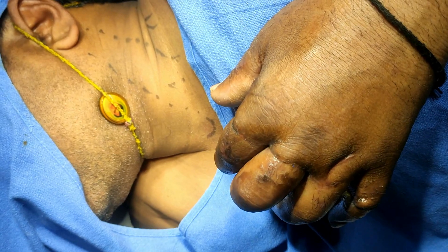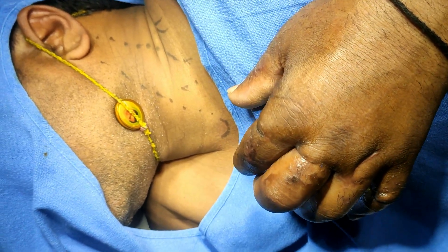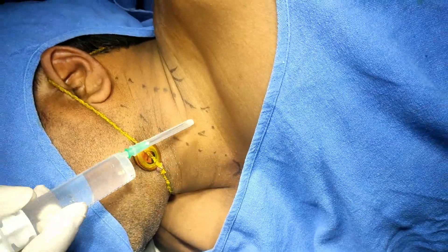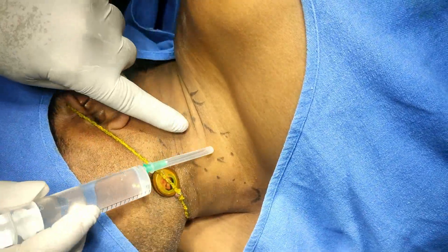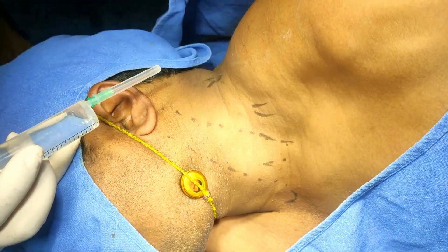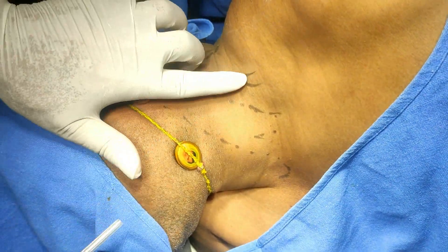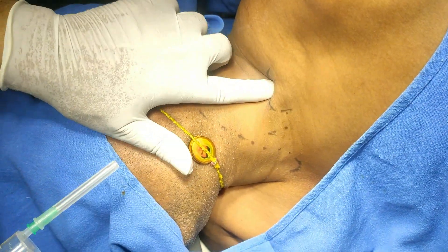The edema should also disappear. Now, here I have made some landmarks: the suprasternal notch here, this is the sternocleidomastoid, this is the mastoid process — these are the two heads of the sternocleidomastoid. You can see here the external jugular vein, and this mark I have put is the inter-scalene cleft.